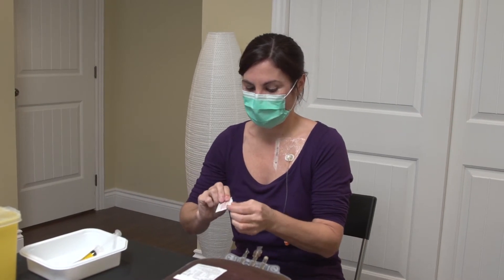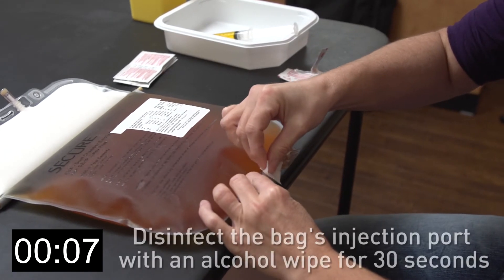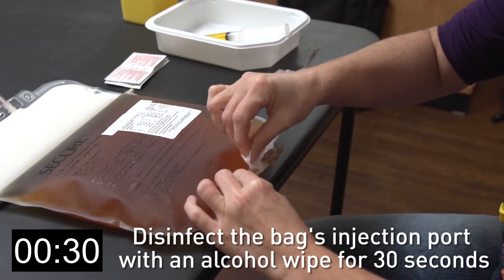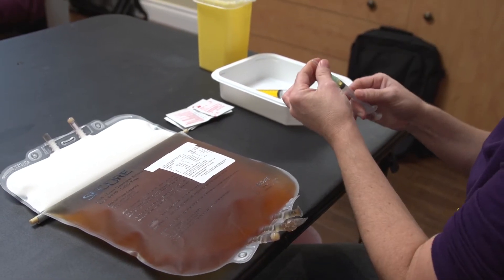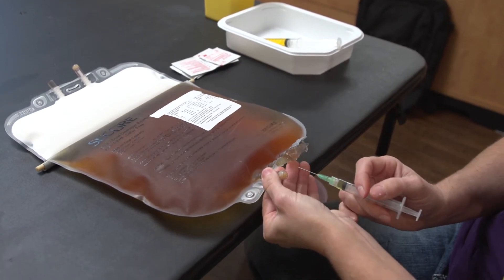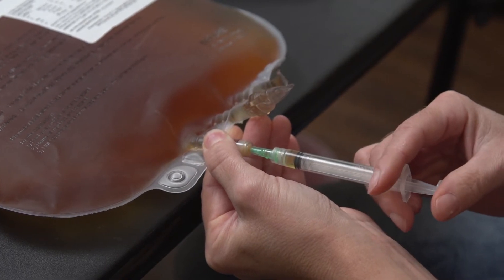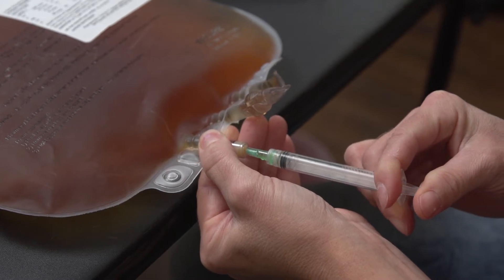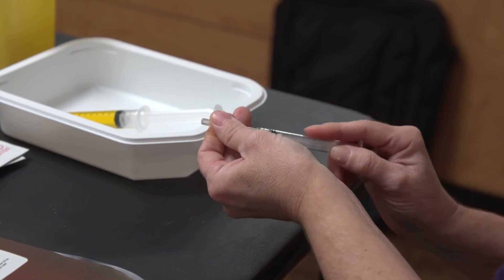Disinfect the bag's injection port with an alcohol wipe for 30 seconds. Discard the alcohol wipe in the wastebasket. Hold the 3 milliliter syringe in one hand and remove its protective cap with the other. Insert the needle into the bag's injection port, making sure that it is parallel to the work surface to avoid puncturing the bag. Push the plunger, making sure that the syringe's contents are entering the bag properly. Remove the needle, cap it, and place the syringe in the tray.